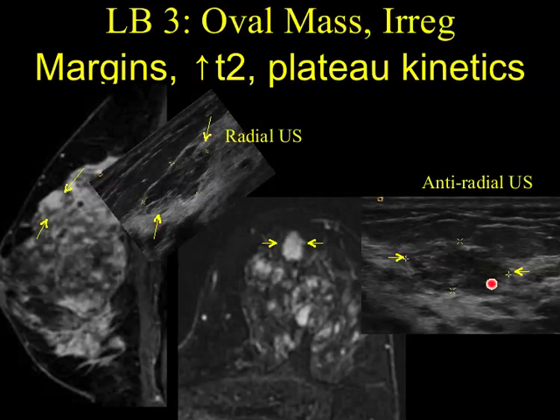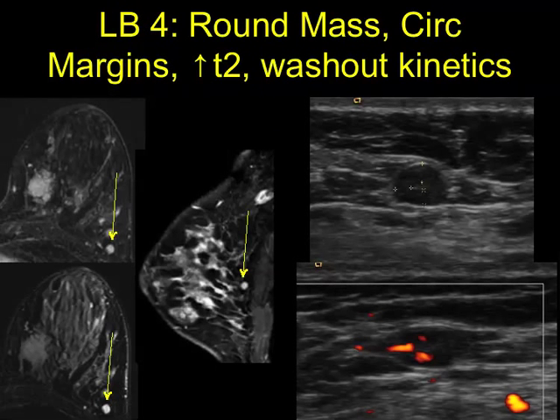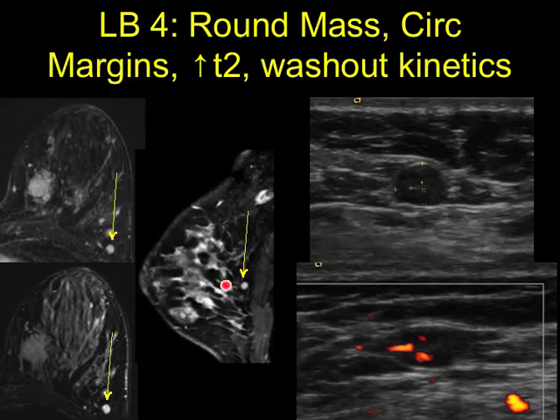That was a sclerosing papilloma. Lastly, we have this small round mass, very T2 bright. This was early in our learning curve, and I think now we would recognize this as an intramammary lymph node. We're going to look — it's a deep structure, it's round, it fits the size correlate, surrounded by mostly fat with a little bit of echogenic tissue, and we can see the signature vascularity of a lymph node with the efferent vessels exiting the hilum.